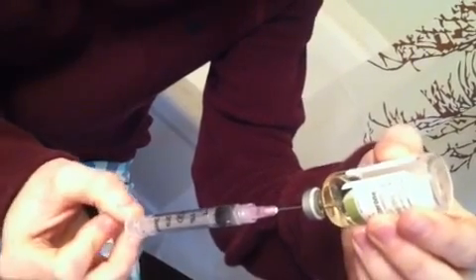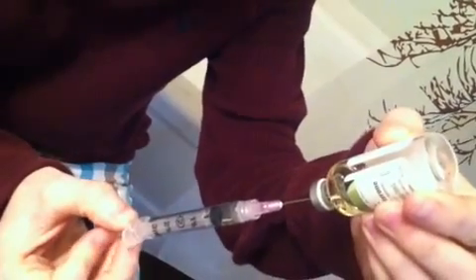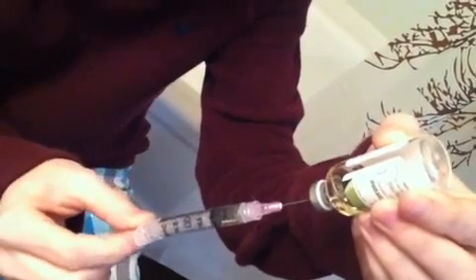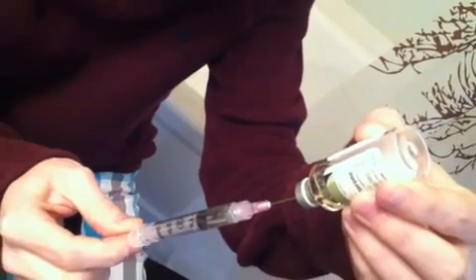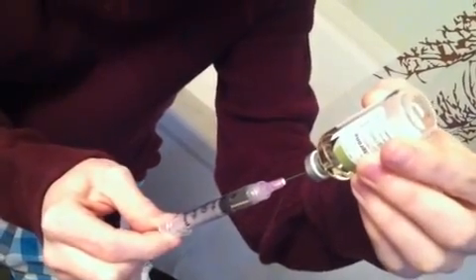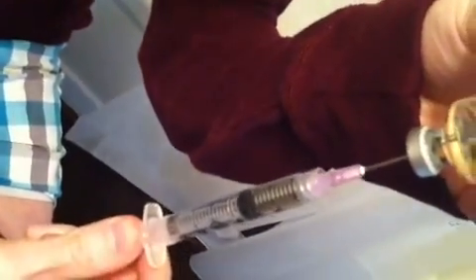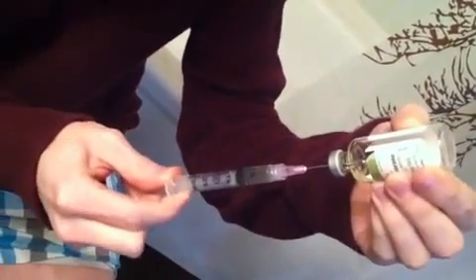I take 1 milliliter every week. My nurse always told me to go a little bit past it, that way you can make sure that you get enough in there. I always try to get the bubble out to make sure that it's not counting the bubble. So as you can see, it's a little bit over 1, and then you push back to 1, or wherever it is that your dosage is.